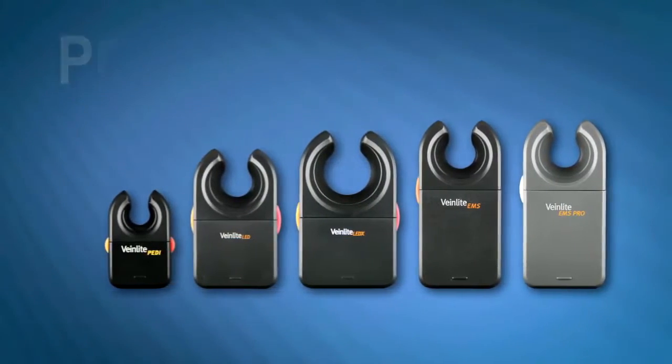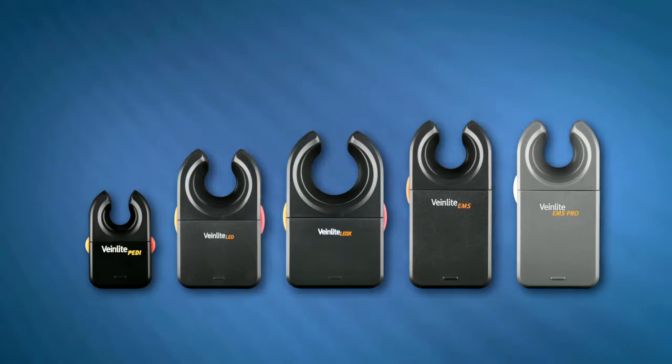The VeinLight is a handheld, battery-powered vein-finding and accessing device that utilizes a patented transillumination technique called side transillumination.